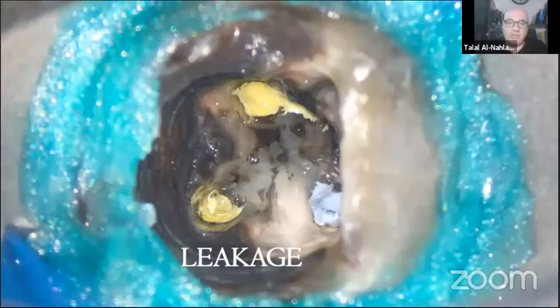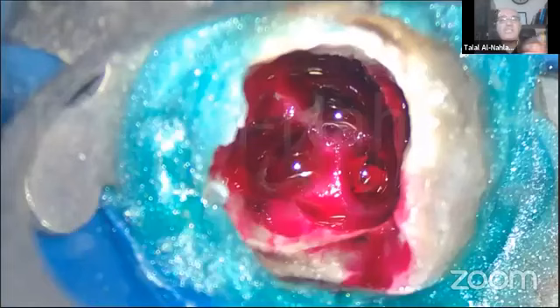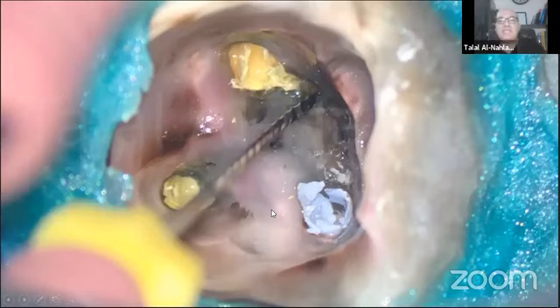As you can see, after removing the obturation, we see a lot of leakage. We remove everything. This is just to show you how much the leakage is influencing. This is dye like a caries indicator, and you can see the amount of leakage all around the obturation. You understand that we have to retreat everything. And this is the missed canal, the distobuccal canal. And now I have to remove the broken file in the mesiobuccal canal.